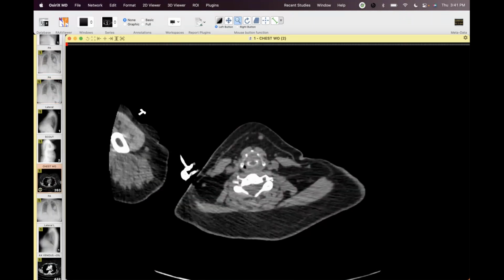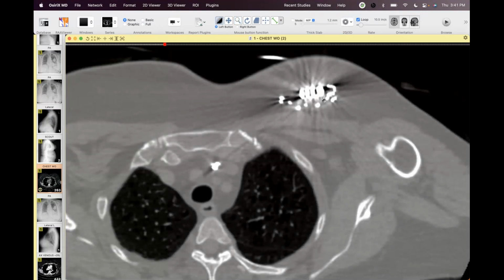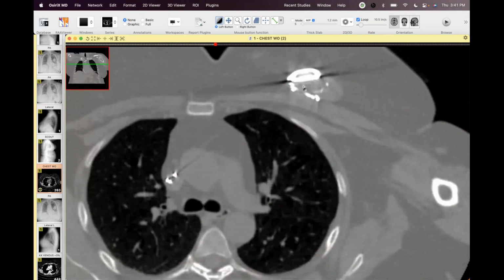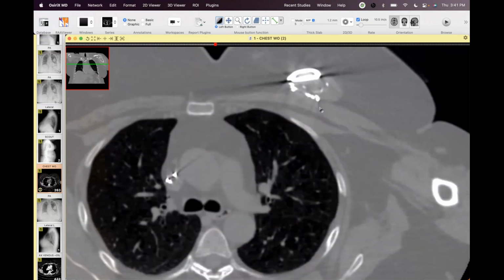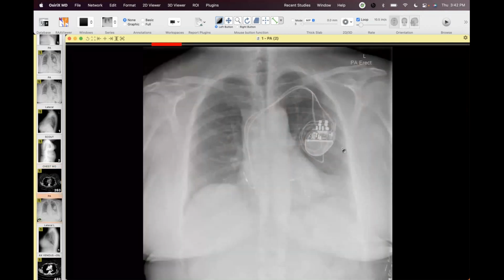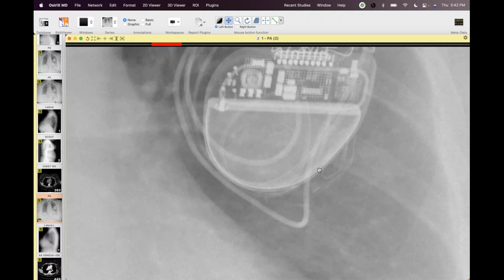So this was another one, and on CT this was not recognized at first. It was just seen that there was a fluid collection around it, and they were suspecting that it was infected. But this was the same material, this Quick Clot, and all I can say is be on the lookout, because this stuff is incredibly poorly designed from a radiographic standpoint. That's virtually invisible there.